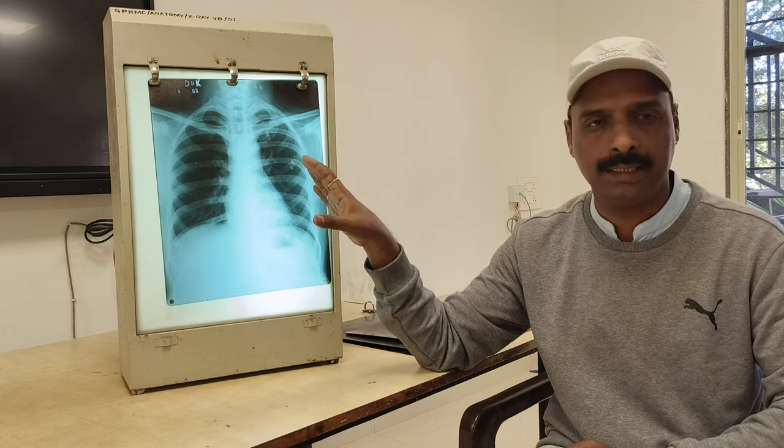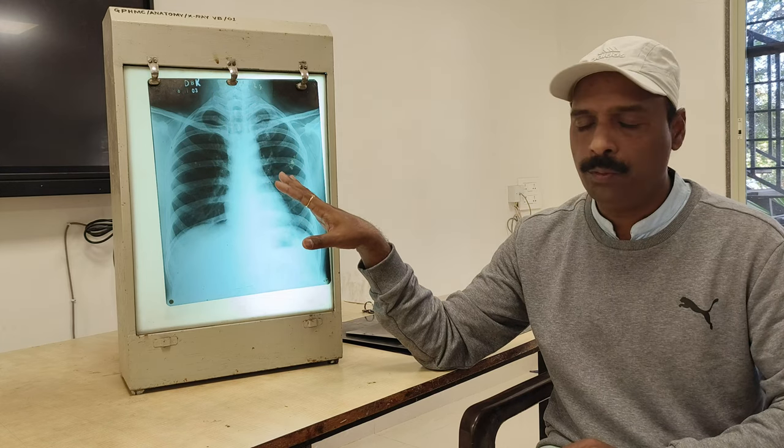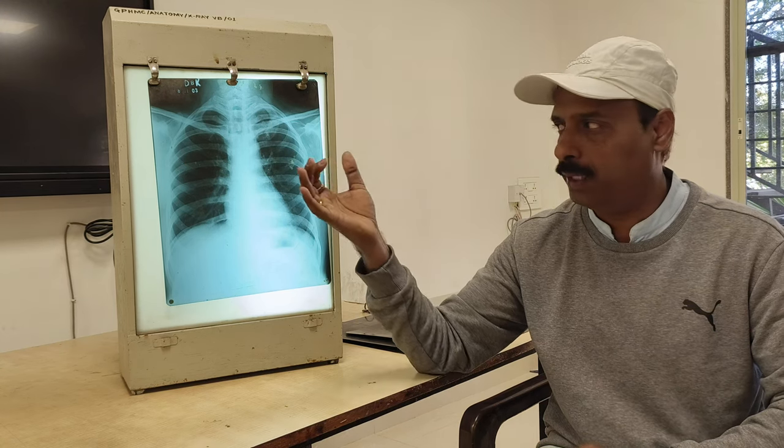But in anatomy, as you have studied, you have to read the normal x-rays. The x-ray gives radio-opaque images. In our body, different tissues are there: we have air, we have fat, we have soft tissue, and we even have blood, a fluid, here in the lungs.